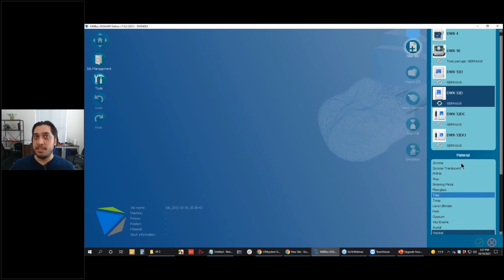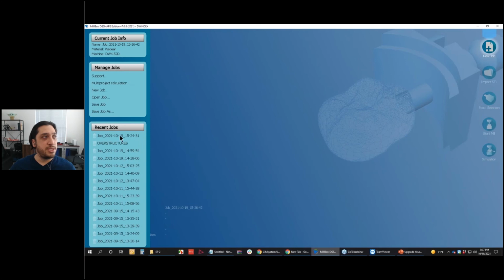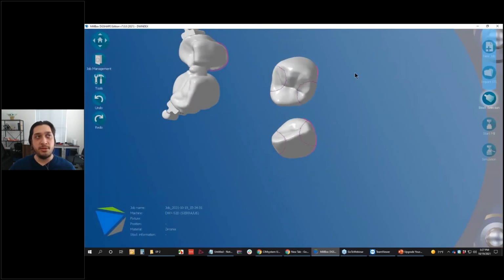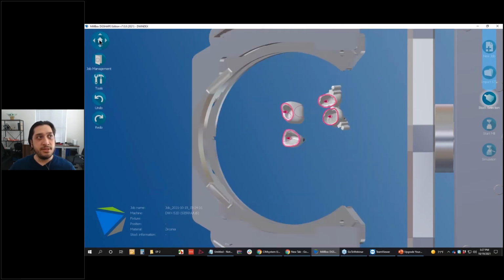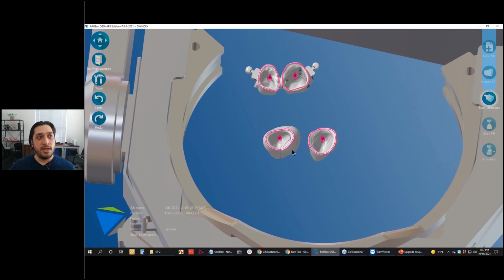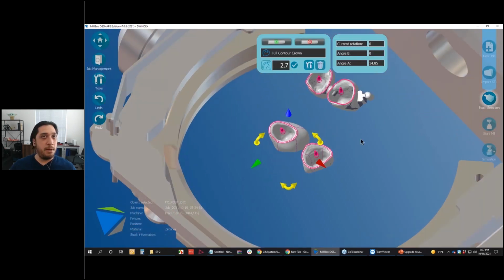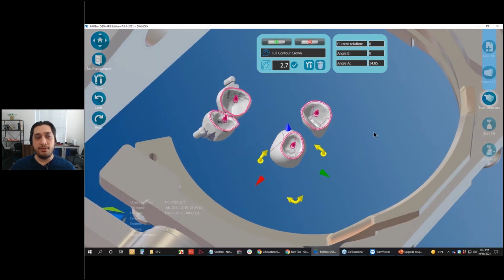And that's a good reason to stay up to date, because as those new materials hit the market, whether it's customers reporting issues to us or dealers reporting issues to us, that's generally what we try to root down to: is the material different? And if it's different, then we may need to create a custom profile for it. So, all right, let's get back to talking about our cavity fit. Because of those different cutting parameters, sometimes it may not gum up on the tools, but you may just notice that parts are not fitting quite as well as they used to, or maybe they're really tight on their fit.